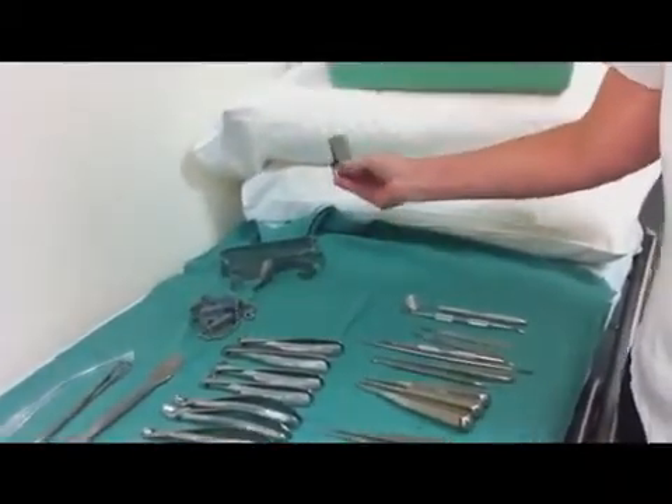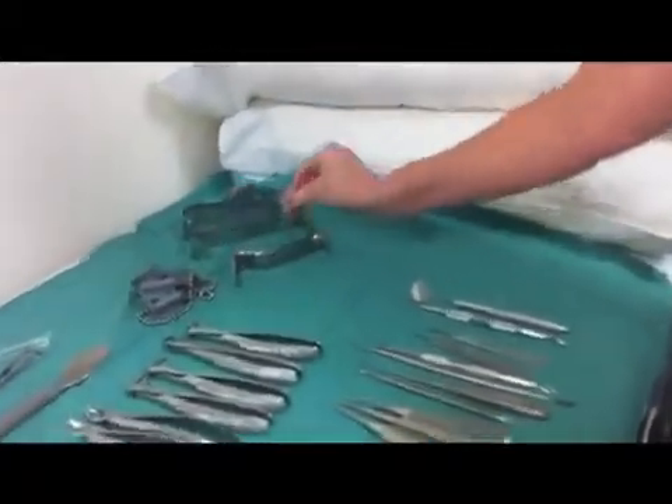That's a Minnesota, that's a flap retractor. And that's for using on upper eights, so it looks pretty obvious what it would do — it would just pull the cheek and the flap right out of the way.